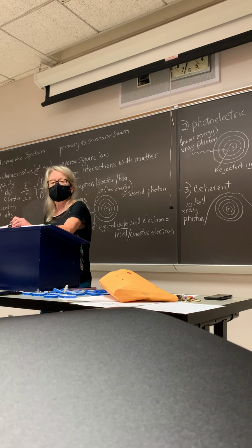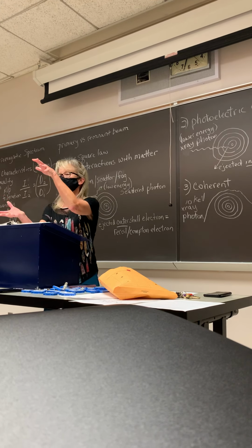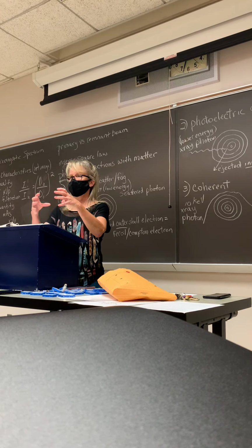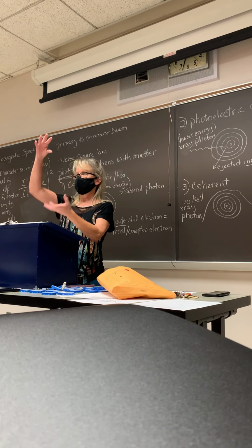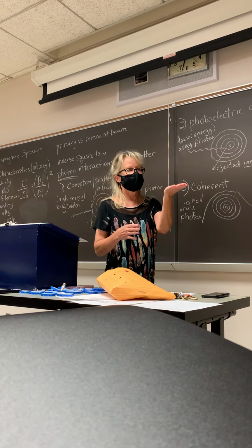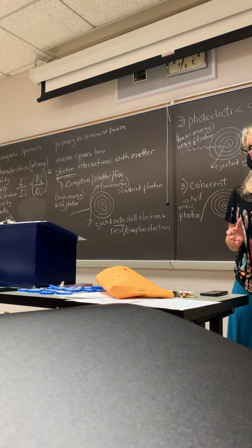Okay, as far as the receptor positioning in fluoro, these are with the machines that you can move. You guys know what the image intensifier is, right? In fluoro. It's that big white, it looks like a big globe. You have the tube and then you have the image intensifier. So one thing you should remember as far as patient dose is concerned, always put the image intensifier as close as you can to the patient.